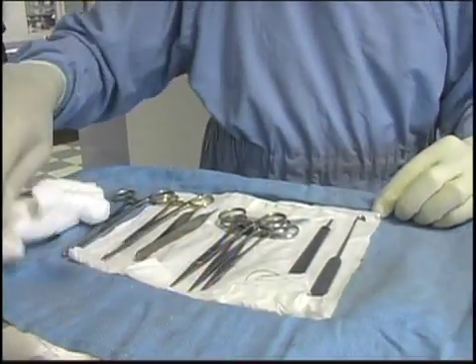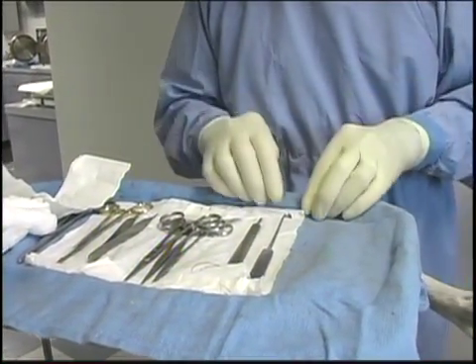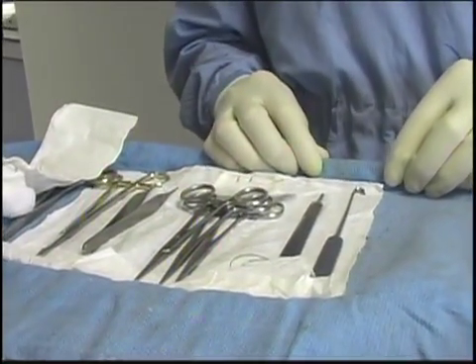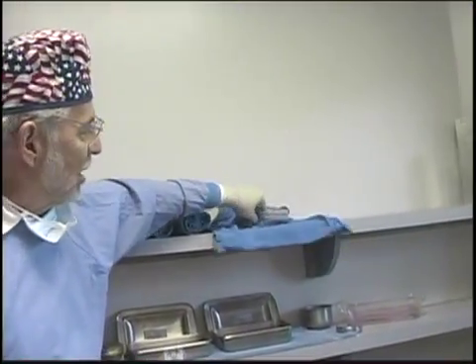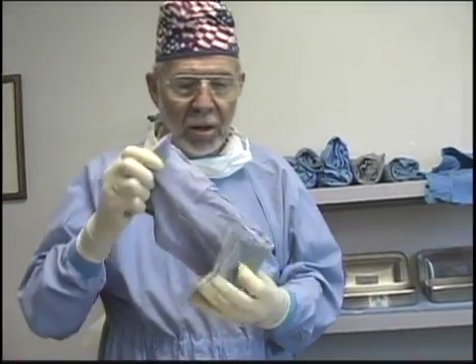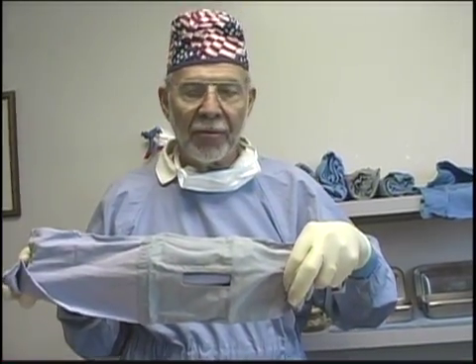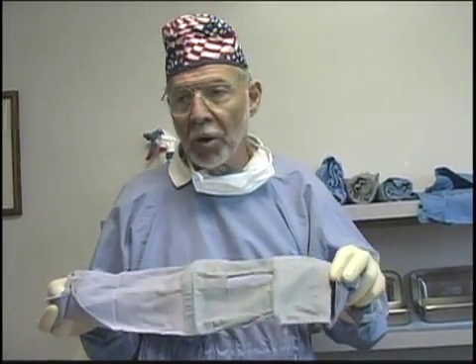That is the sum total of the pack, and I can do anything from this very large dog down to the less-than-one-pound kitten if I need to. We also keep our surgical drapes — they're not in the pack, they're in two separate packs. We have ones with a small fenestration, only four inches, and the large ones are simply an inch longer, which we use for our large dogs.